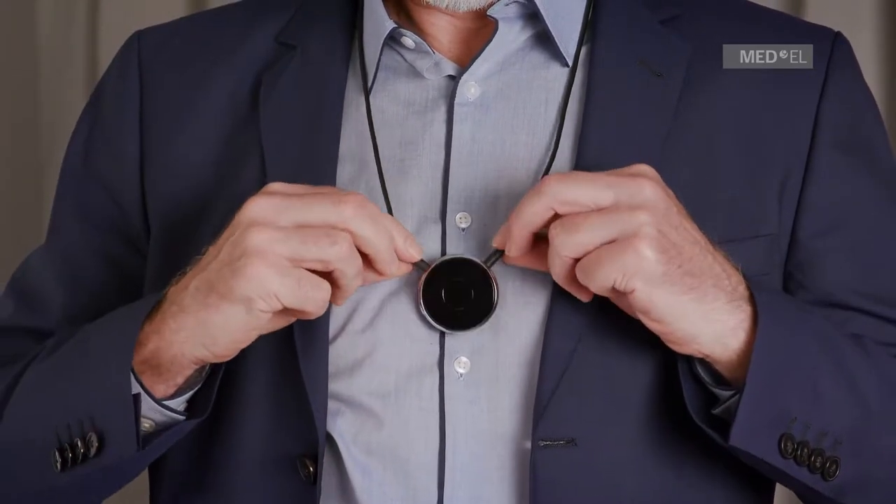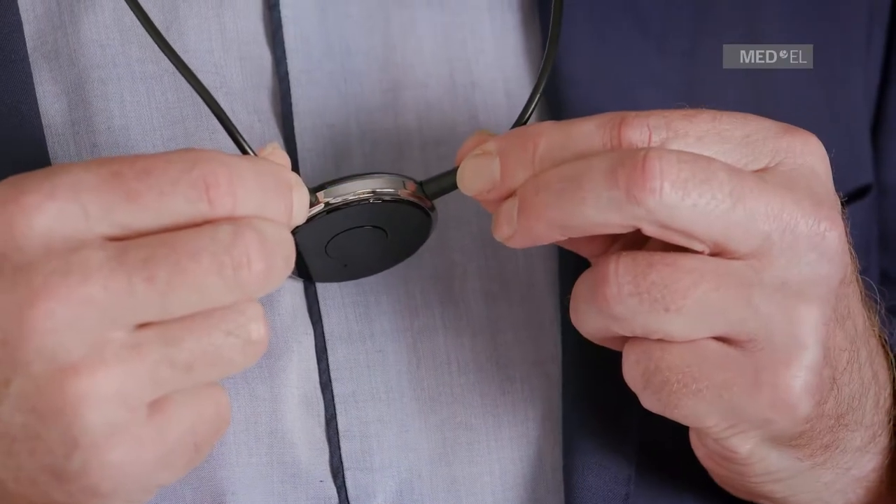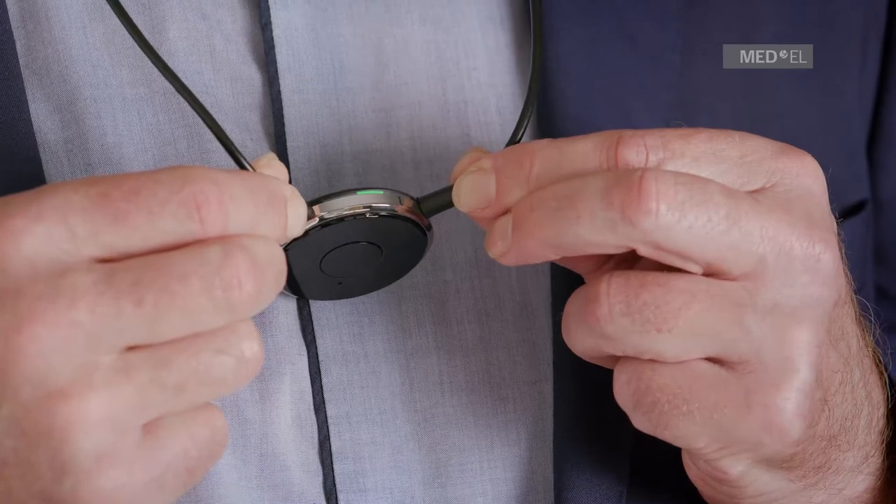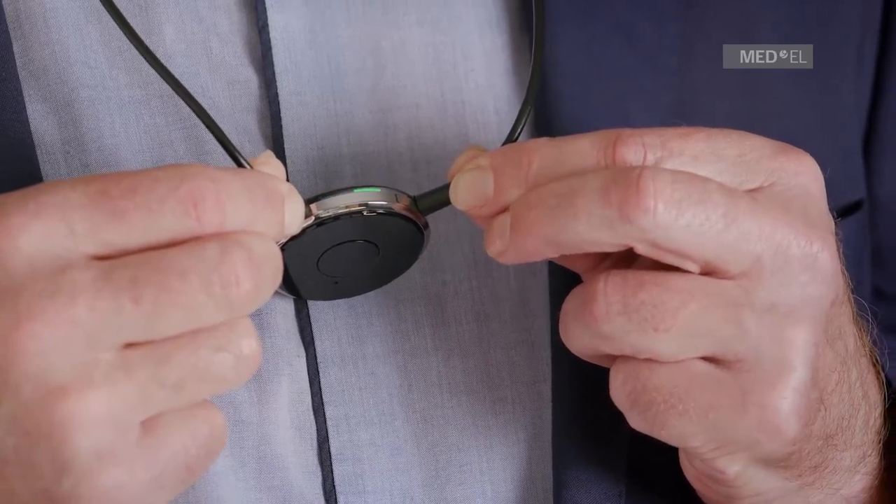Switch on the audio processor while the green LED is flashing. Pairing is complete when the green LED stops flashing, is illuminated for 5 seconds, and then is no longer illuminated.